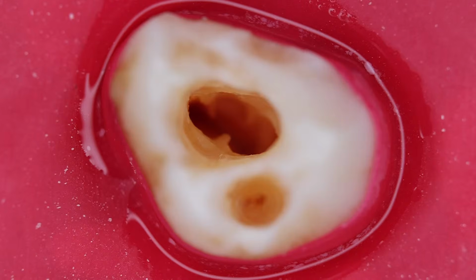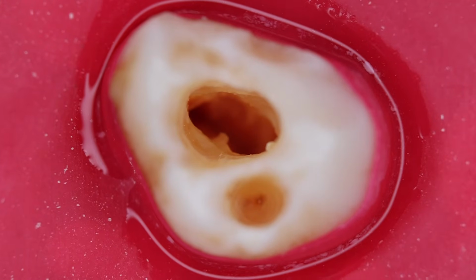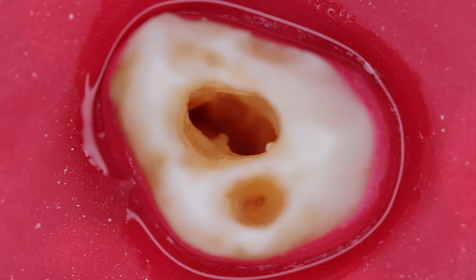So we have done it, and now let us look if we have secured the mesobuccal 2 canal over here. And now let us irrigate it. This time again we are going to use normal saline as an irrigant.